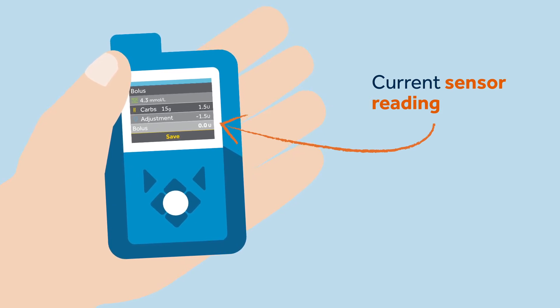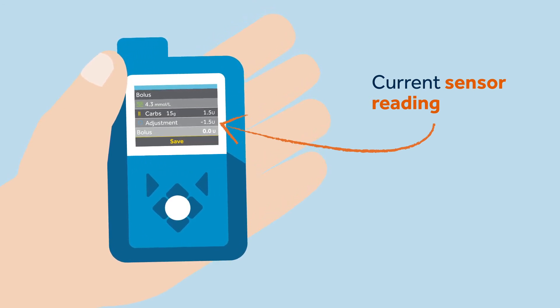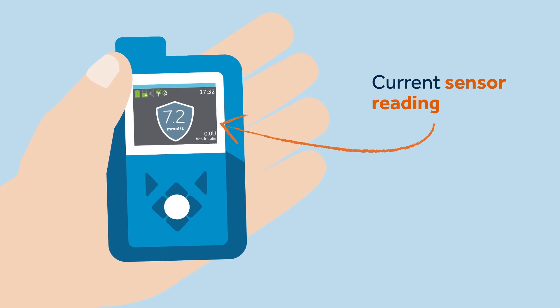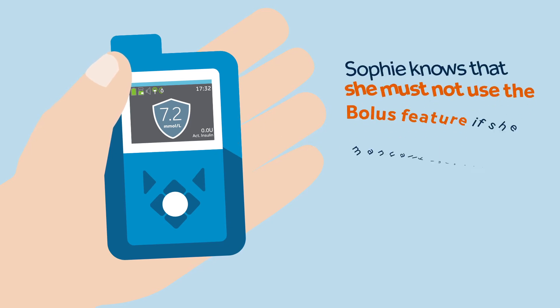Insulin for carbs will be displayed together with the total bolus, total correction, and food insulin. She then selects next, followed by deliver bolus. After delivering the bolus, the pump returns back to the home screen, which shows the SmartGuard feature blue shield with the current sensor reading.